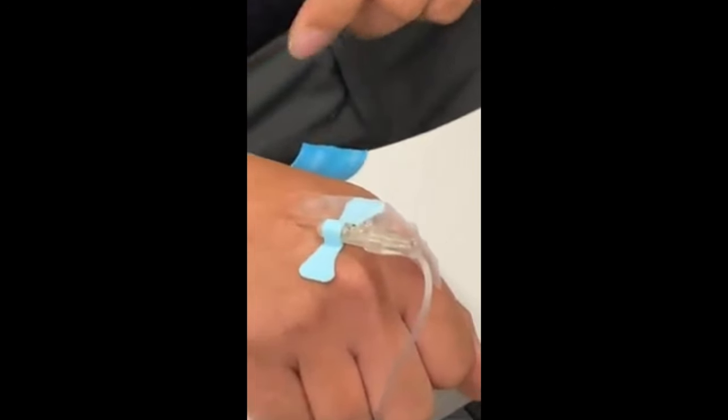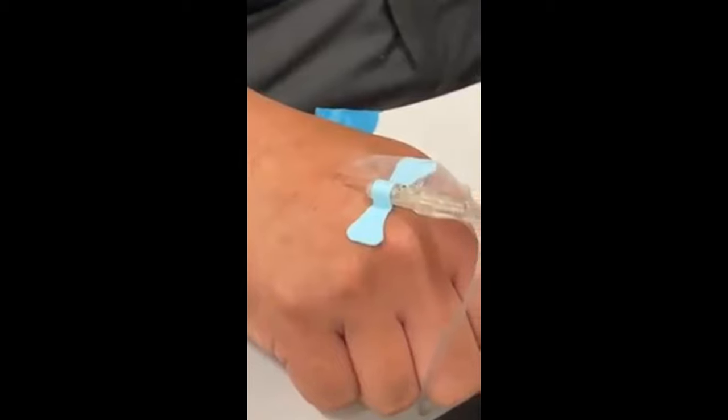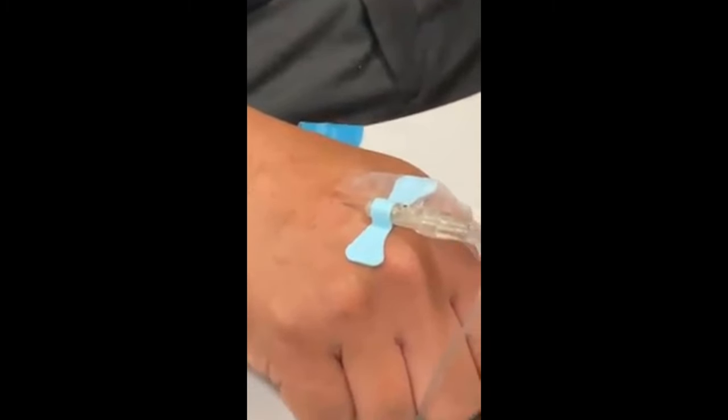You already did the tube. Okay, so that's the last tube. Before you remove it, what do you remove? The tourniquet. Okay, tourniquet, perfect. So after you remove the tourniquet, you can remove the tube. Perfect, while in motion, and then invert. Once you invert it 8 to 10 times, then you could set your sample down.